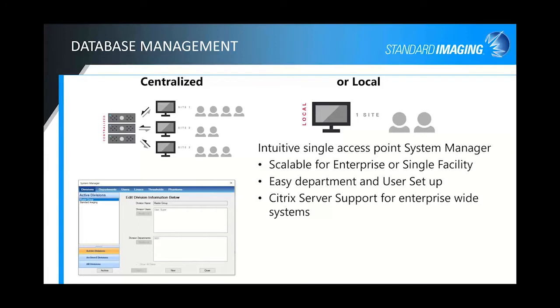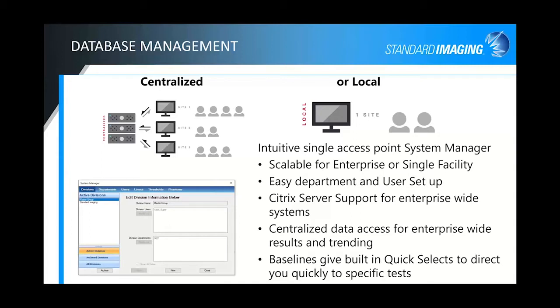And Citrix server support for enterprise-wide systems. And again, like I mentioned, the centralized database for your enterprise-wide results and trending. And baselines give you the ability to set those up and then have quick selects for the tests that you want to do and jump directly into.